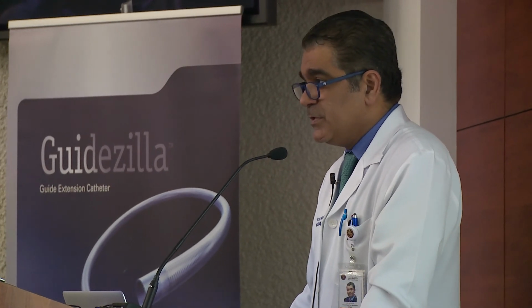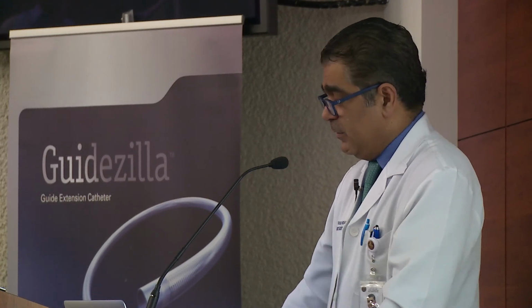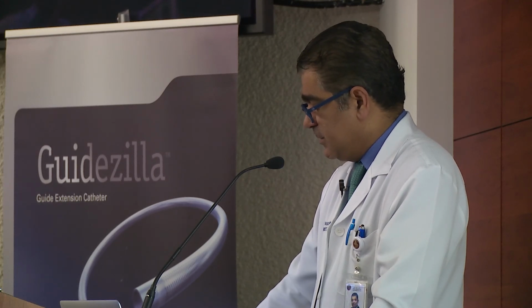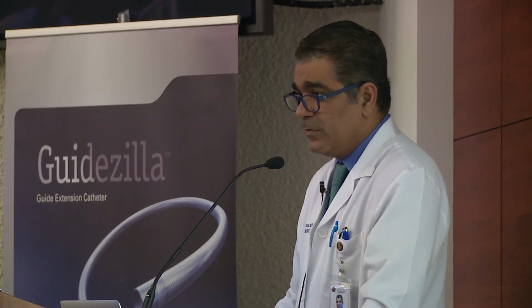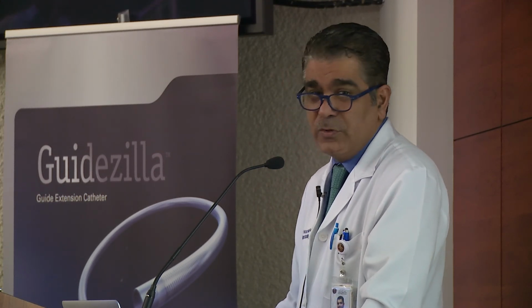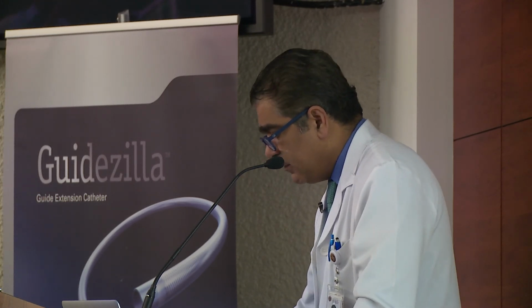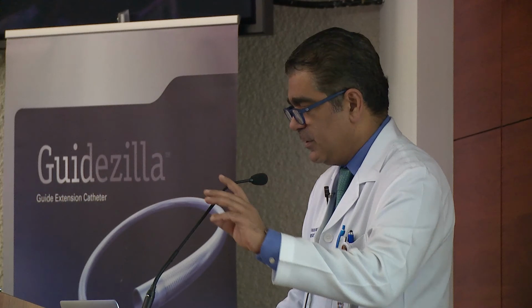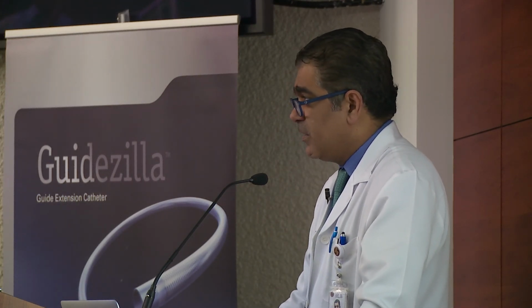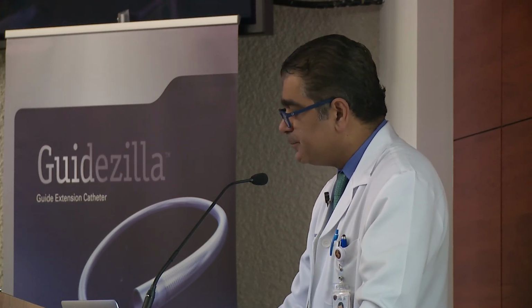Most of the time, as we discussed, we try with an antegrade approach, and that fails. You have to have retrograde skills to bail out and finish the case. However, the issue with retrograde is that retrograde procedures are in general associated with a higher complication rate, especially the ones we fear a lot about: perforation, cardiac tamponade, periprocedural MIs, et cetera. So be very cognizant of the risks associated with retrograde procedures.